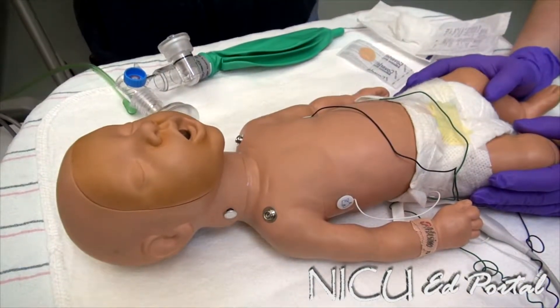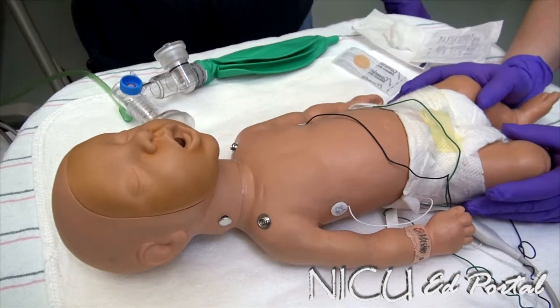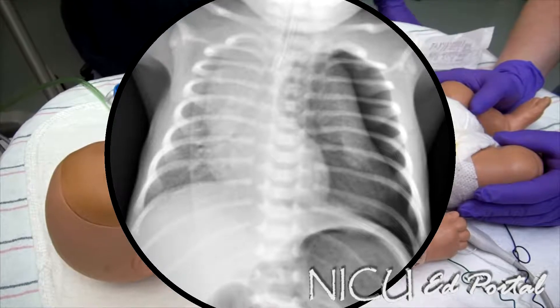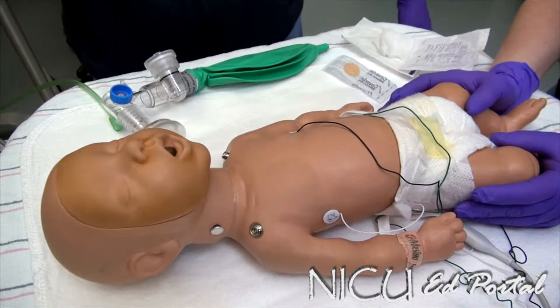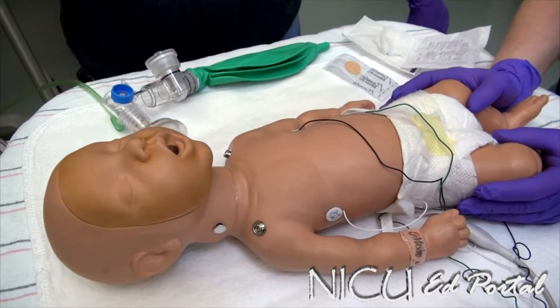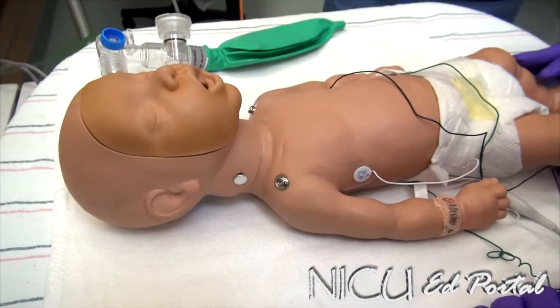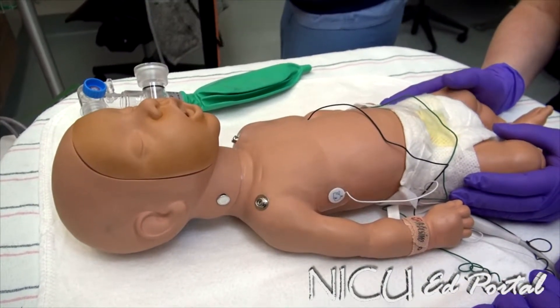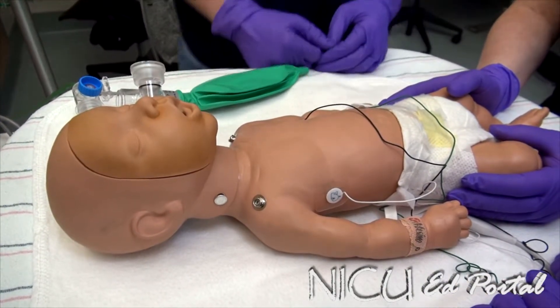If the baby is stable and time allows, you may obtain a chest x-ray prior to needle thoracentesis to confirm your suspicion. However, if the baby is unstable, proceed with the needle thoracentesis emergently. We now have a pneumothorax on the left side, so we want to set up for a needle decompression.